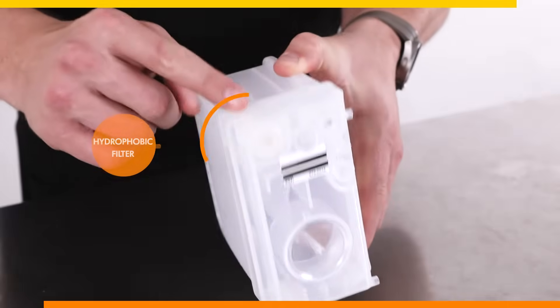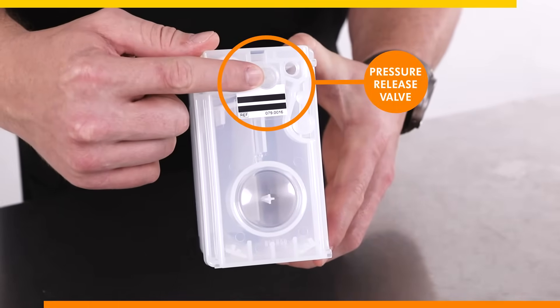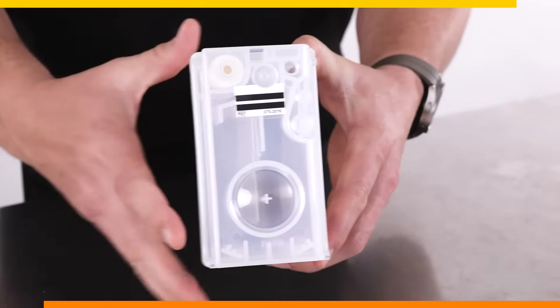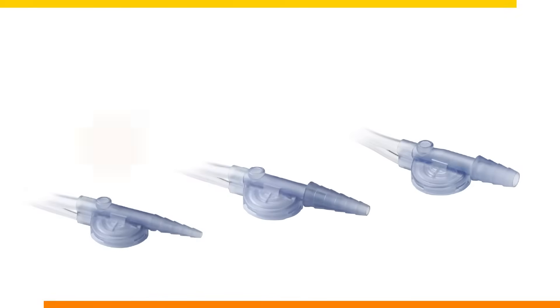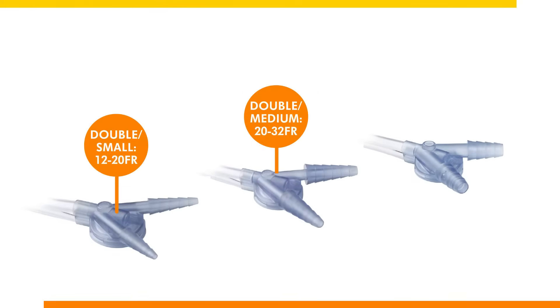Each canister is equipped with a hydrophobic filter to prevent overflow, a pressure release valve in case the patient coughs, a sticker for canister size detection, and a sealing cap to seal the canister prior to disposal. There are different tubing sizes depending on the size of the chest drain, and you can connect multiple chest tubes unilaterally to the device by selecting a double connector and tubing extension set. These are contained individually in sterile packaging.